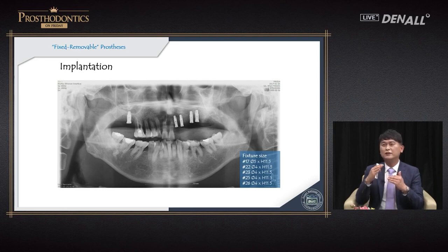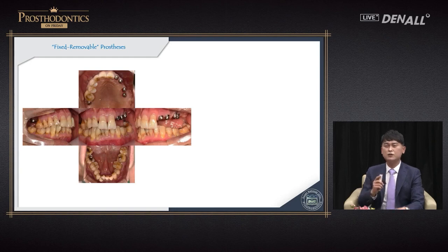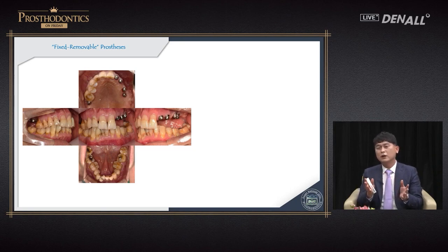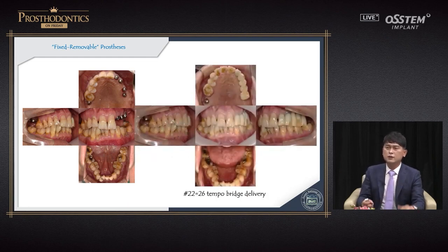Before I finish, let me introduce this case. I will try to keep time. If you look at this case on the right, at quadrant 2, 4 implants are placed. The patient came to me like this, labial version buccally. There is a big vertical space and the sinus lift was properly done, but we cannot really blame the surgeon. We need to solve the problem with a fixed prosthesis as the patient wanted it, and we provided a temporary. We pulled it because we wanted to take a photo, but that much vestibule was visible.